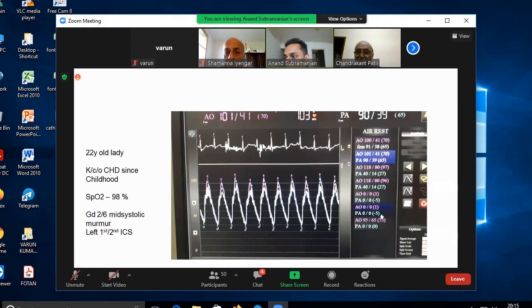We have done this angiogram. This patient did not have any of that, but this was just for completion's sake, to demonstrate a good sized innominate vein and a right SVC. But it's helpful to go through this in adult TOF catheterization so that you don't miss an LSVC, even if it's there.